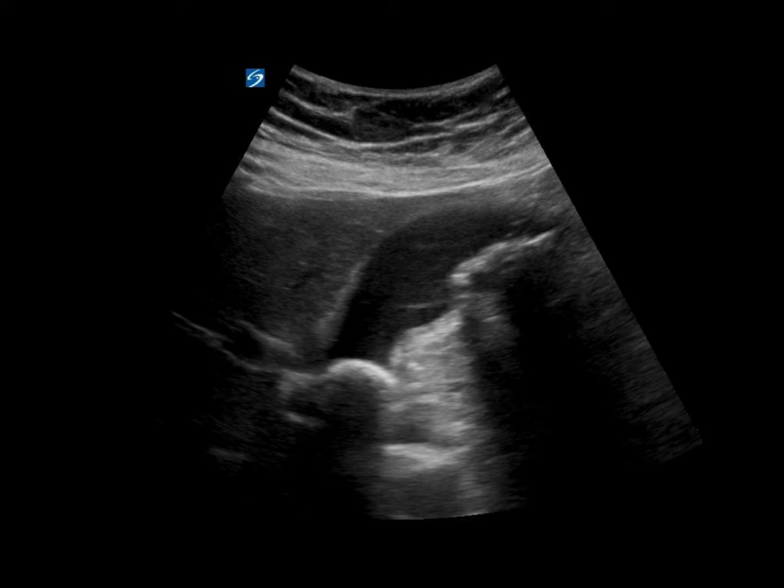So what we see here is we have stones here. Let me put those in purple for now. There are stones up in the fundus, and here's a stone right here in the neck. We see shadowing and shadowing. And what we don't see, compared to the others, is that we see this back wall, we follow that, and then it disappears to the stone. There's no taper like there was before in that last image.